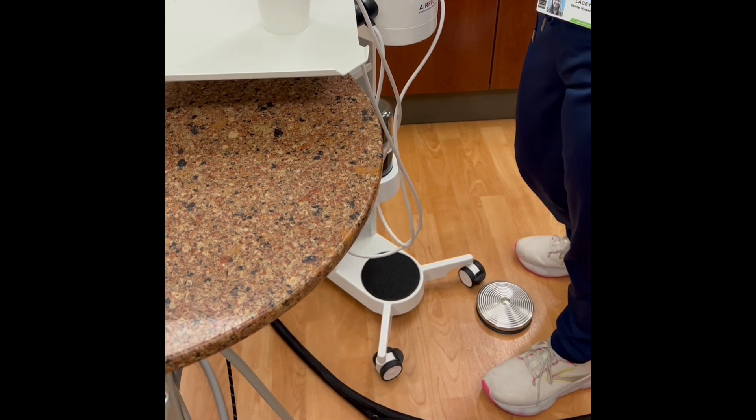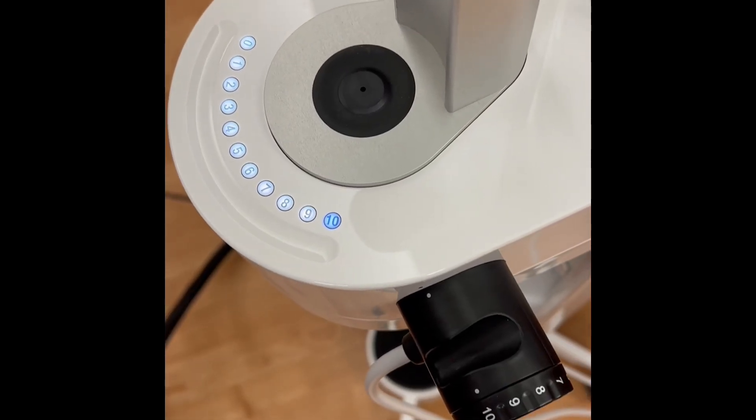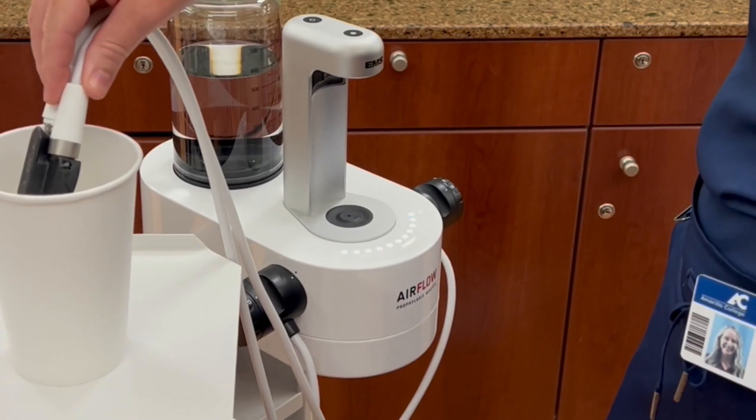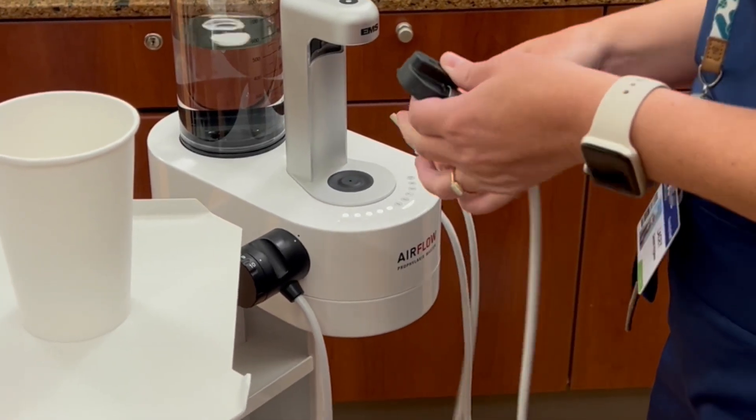Press the foot pedal once to begin purging. A blue and white countdown will be displayed on the unit. When purging has completed, replace the hoses and ready your supplies.